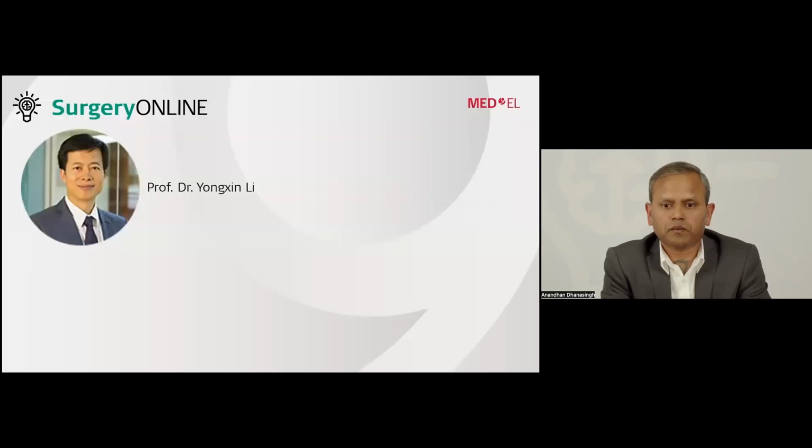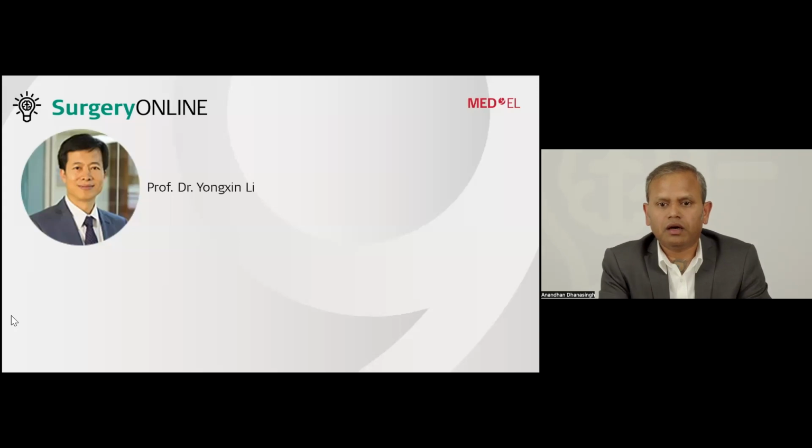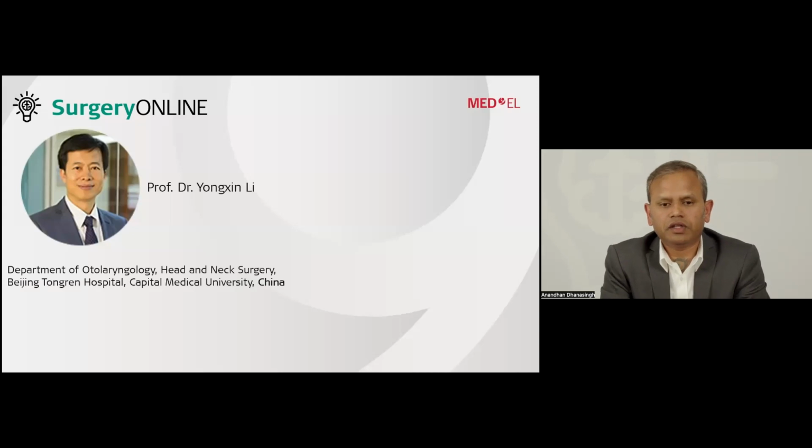To find an answer, we will listen today to Professor Yongxin Li from China. He is the head of the ENT department in Beijing Tongren Hospital.